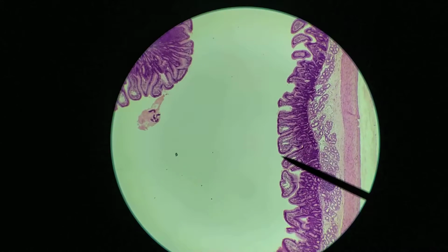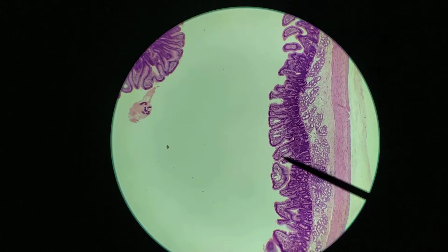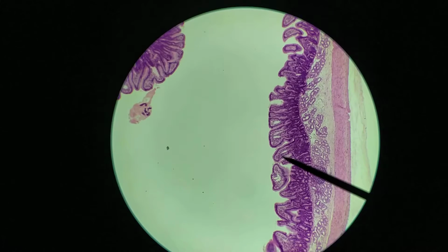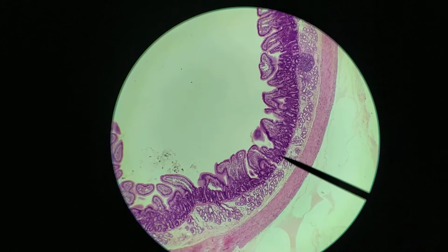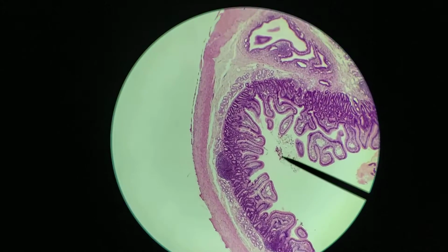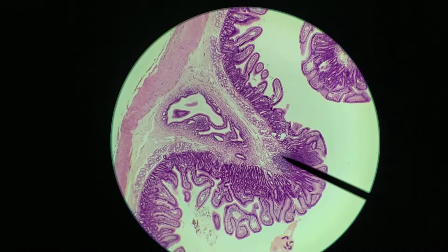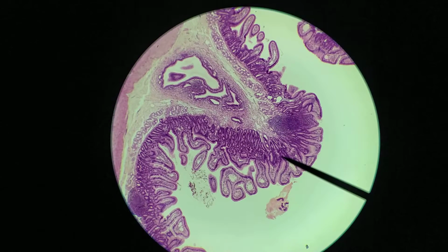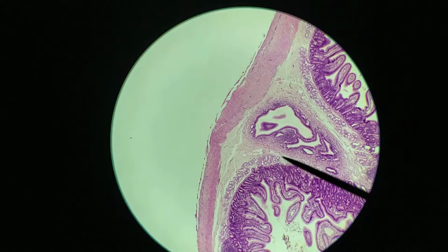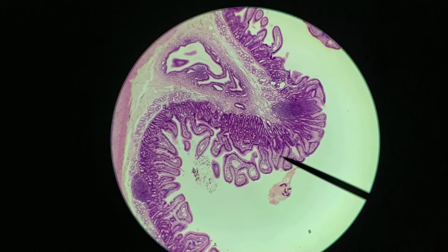The lumen is right here. What we're looking at here is a villus. That's the villus at the pointer. That's a relatively flat area here, but as we move along, we're going to see a region here which kind of juts into the interior. So it's a fold that is containing both the mucosa as well as the submucosa, and goes into the interior.